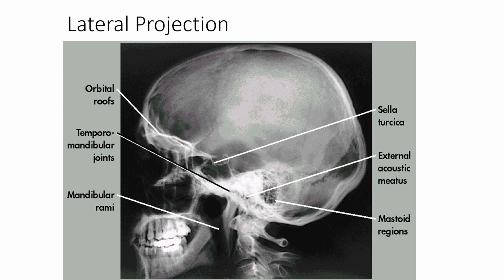That's going to manifest as a non-superimposed cranial floor between the orbital roofs and the sella turcica. It's going to look kind of like there's two of them. Rotating the head left to right, that's going to be non-superimposed mandibular rami and TMJs. Okay.